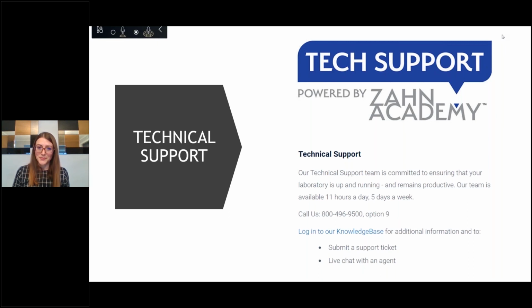Okay, and the next one, is this officially supported by 3Shape? So the VPN connection itself is not officially supported because there's a lot of IT involvement and network issues that technical support team mainly focuses on application support, right? However, just like our team, they are willing to help. A lot of times, we know where issues reside, or we are familiar with things that could go wrong simply by working with our customers. So at the very least, we can definitely help determine whether the issue is 3Shape software related or PC related or network related, and give you the proper tools and information to reach out to your IT so that you know exactly what to ask and what needs to be done, if we can't help fix it.